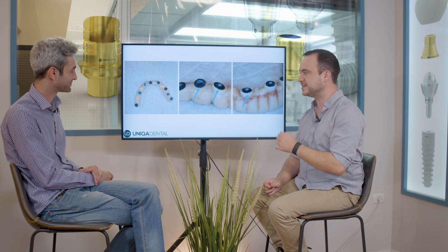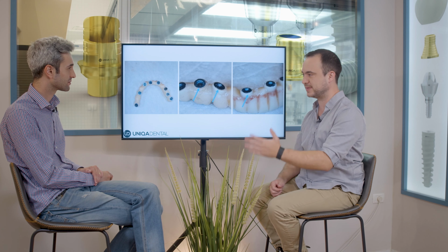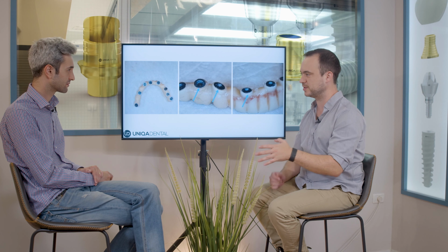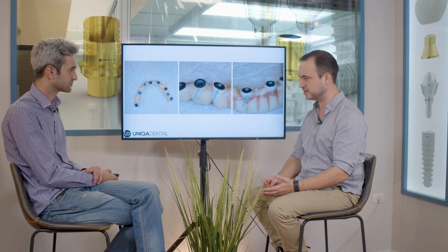And when we have cemented all of the sleeves and we take out the bridge, we want to clean the residues of the cement, everything. We don't want to put the bridge inside the mouth with all the residues of the cement. Yeah, we'll have inflammation. It's not a cemented restoration, it's a screw-retained restoration. So we can take it out, then we can clean all the residues of the cement.